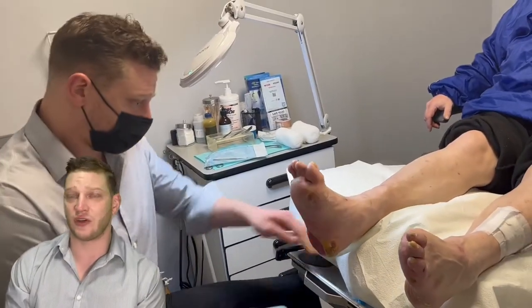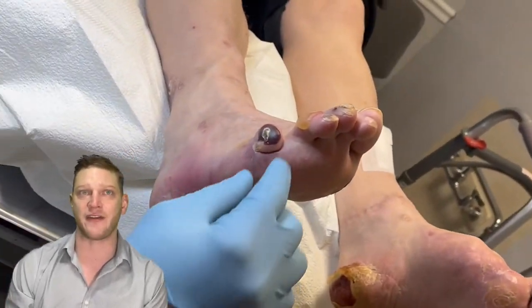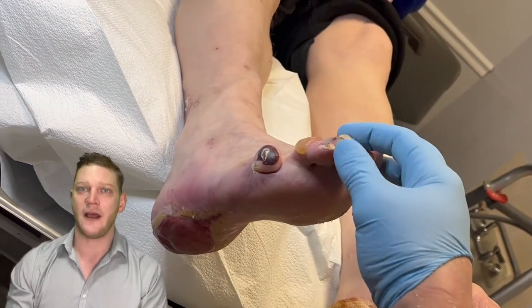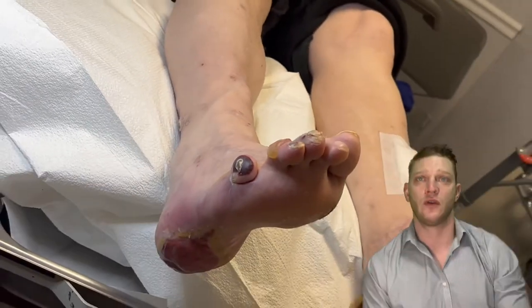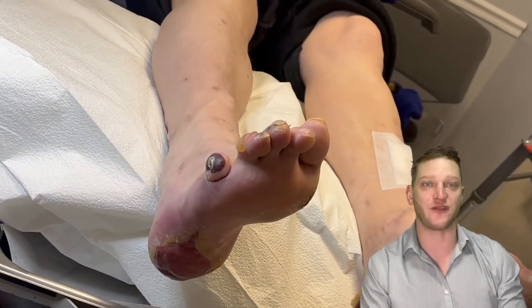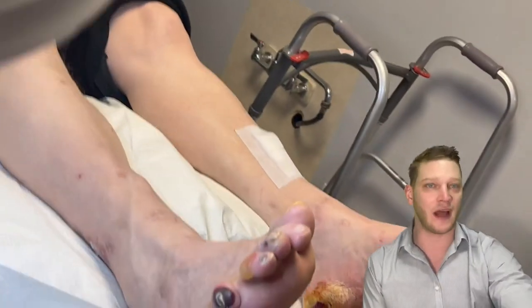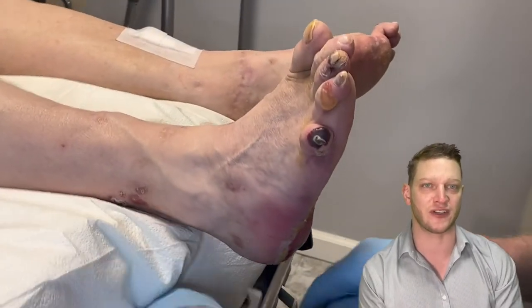You can see this black part of his toe — that is literally a hemorrhagic blister. It's rather tense, and because the hemorrhagic blister is filled with blood, that is something that bacteria can eat rather readily. So this hemorrhagic blister we have to remove, because it's literally a buffet for bacteria, and we're going to remove every bit of this blood we can.